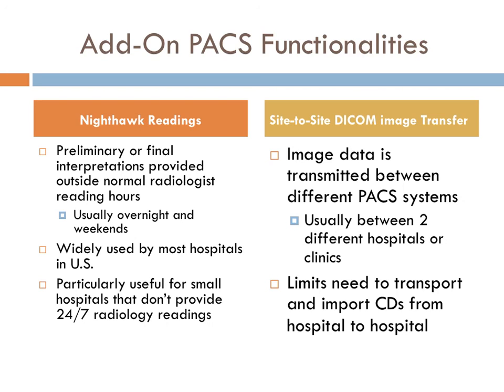So this is what site-to-site DICOM image transfer is. It limits the need to transport image CDs from hospital to hospital. So it knocks out the courier role of an individual who would physically transport images in the film world from one site to another to be read.